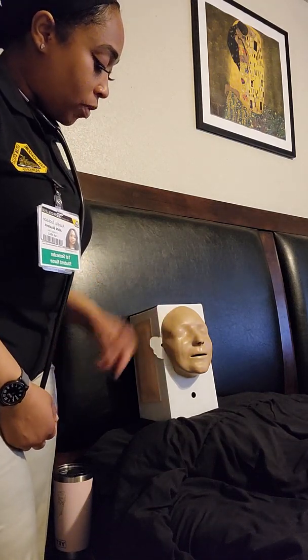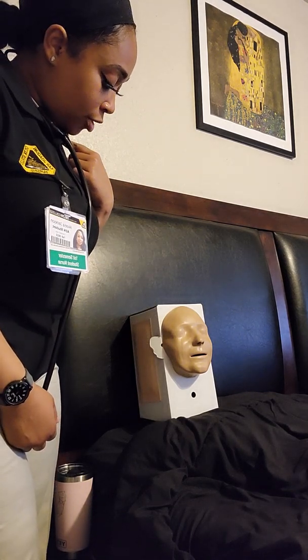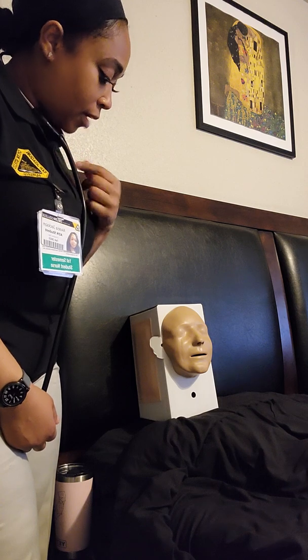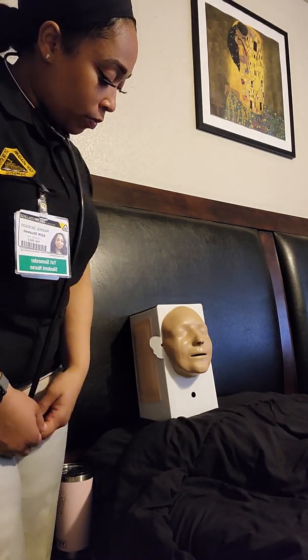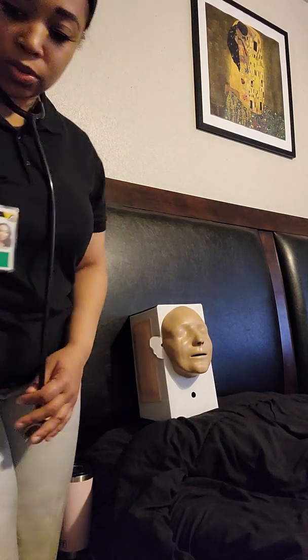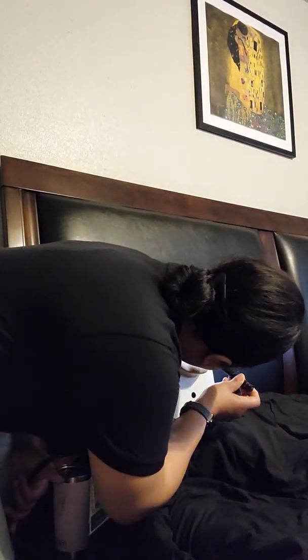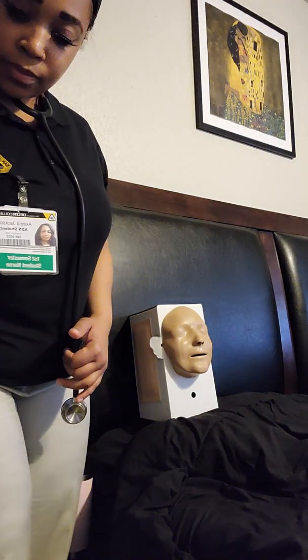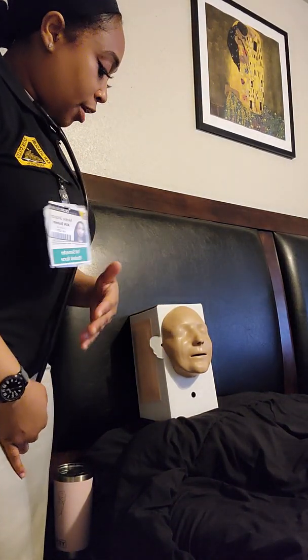So I will have you go ahead and place one of your fingers over your right nostril and breathe through your left. And now do the same on the opposite side. Okay, which nostril was easier for you to breathe through? Your left? Perfect. So I will be inserting the tube into your left nostril. I actually want to go ahead and take a look at your nostrils really quick.